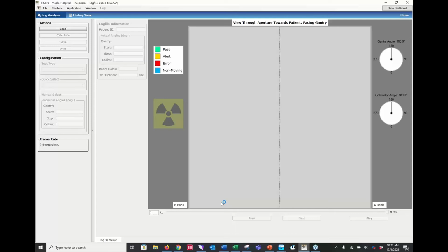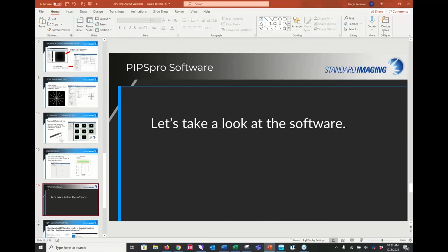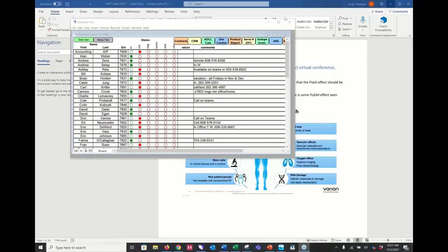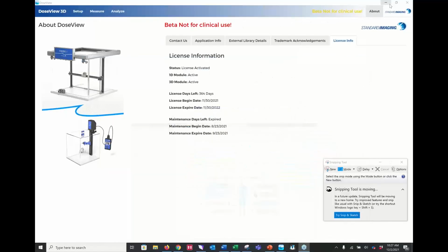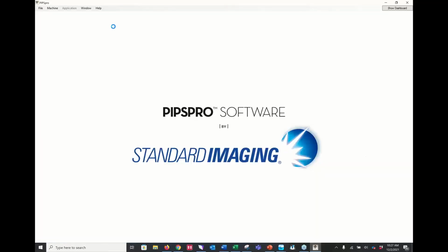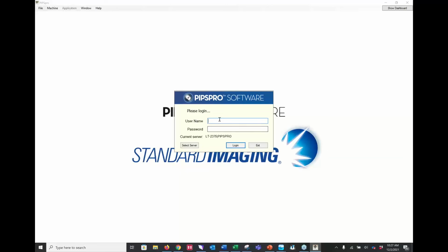and that will open the field. These are a little slow today. Oh, I apologize about that. Not sure what happened there. Let me bring that back up real quick. I think I have too many things open on my laptop today.